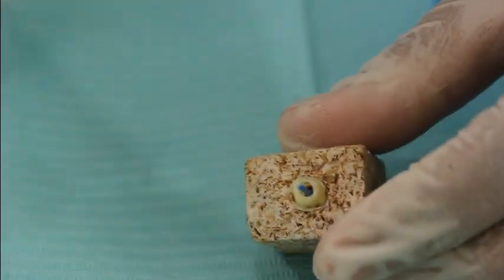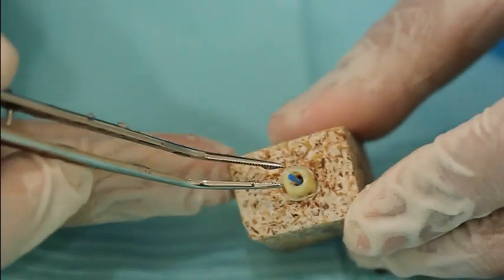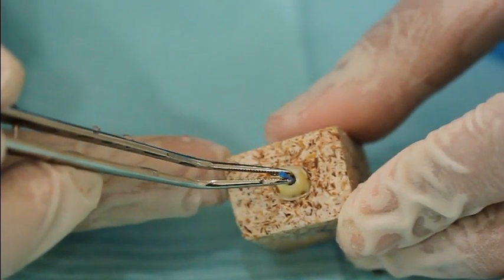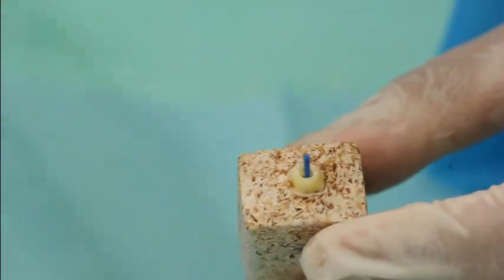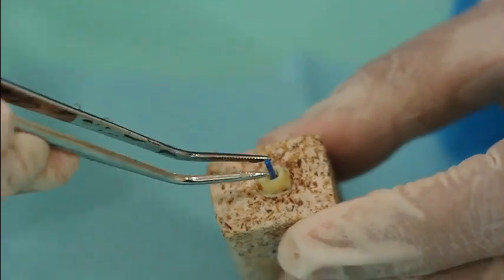Before you take the impression, you have to create serrations on the impression post so that the impression material will stick better to the post.